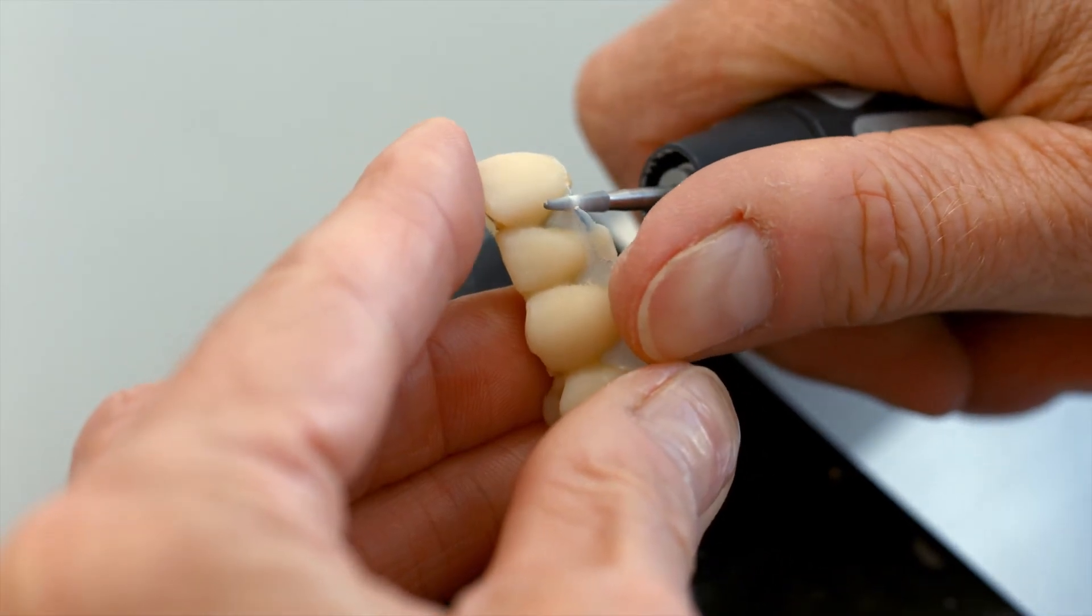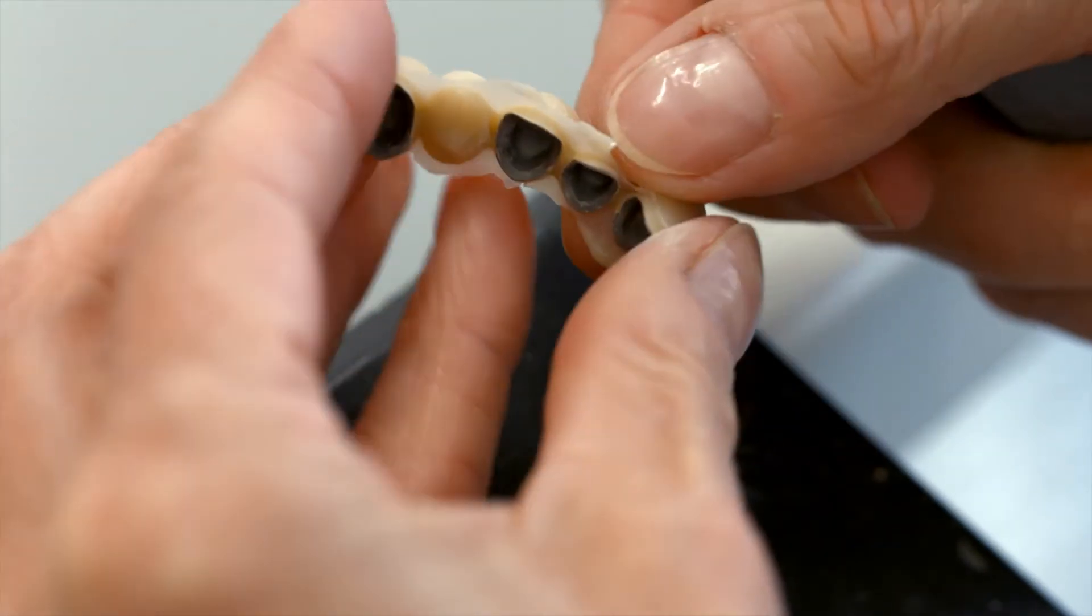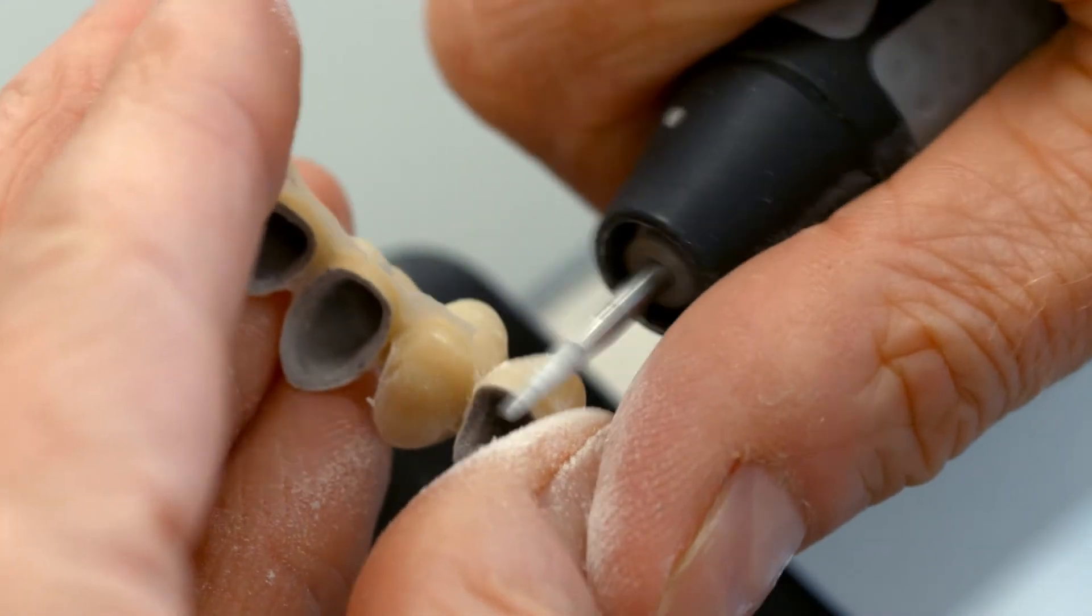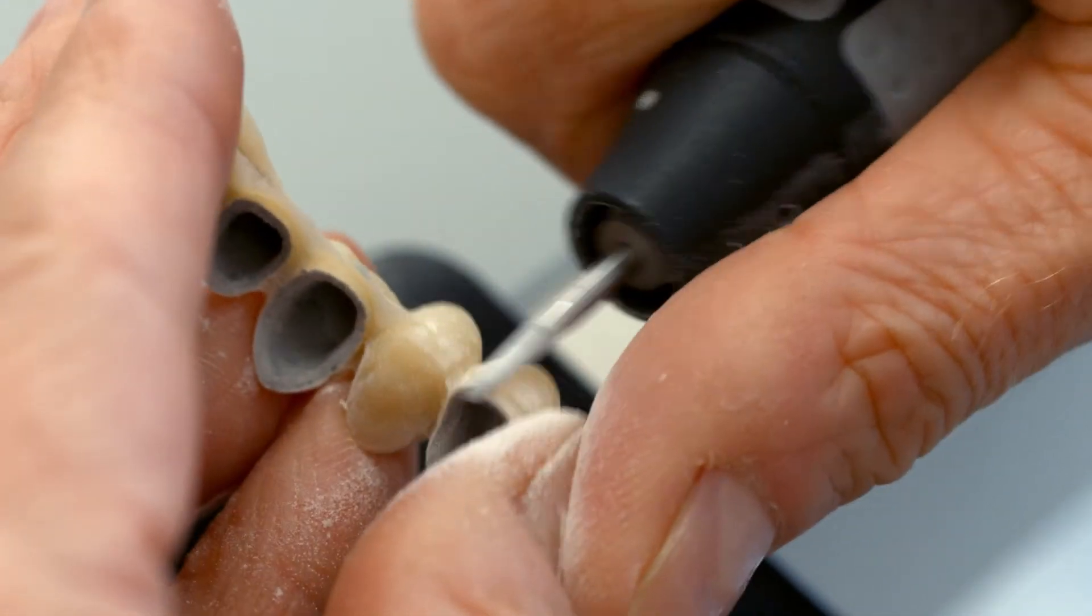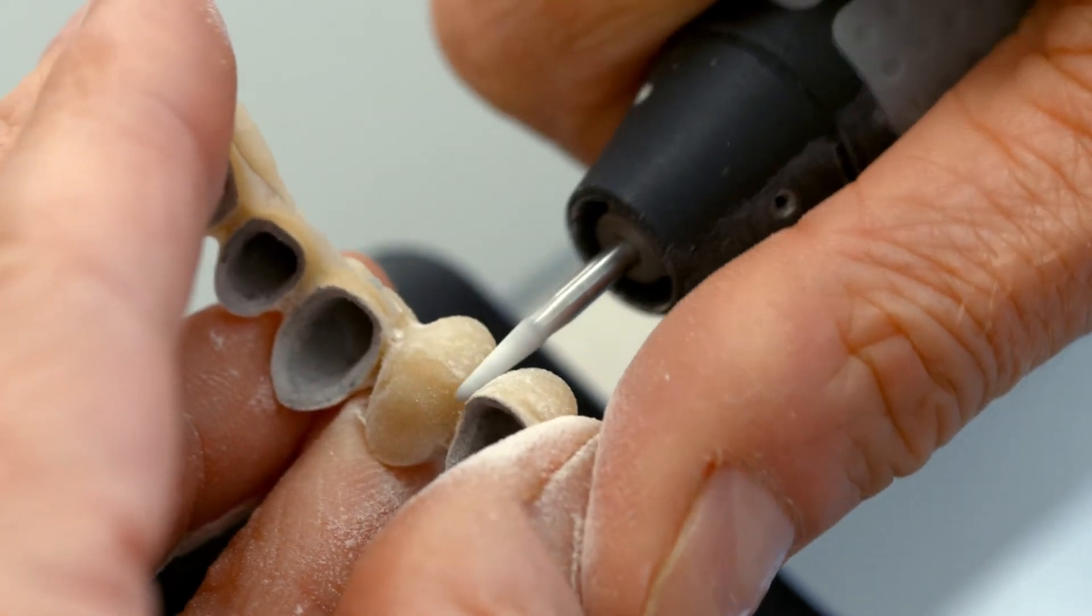A short fine line of composite flash on the bridge indicates that the mold was properly loaded with the restorative material. Remove the flash with suitable grinding instruments.